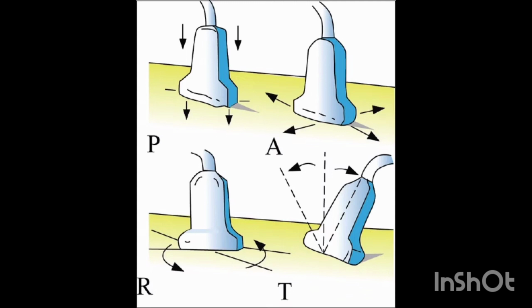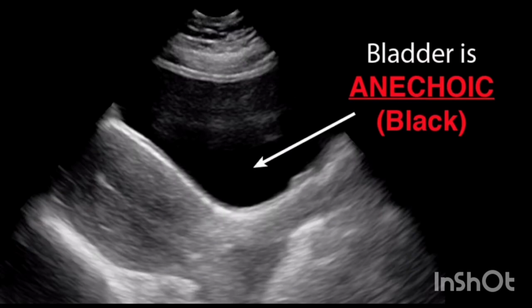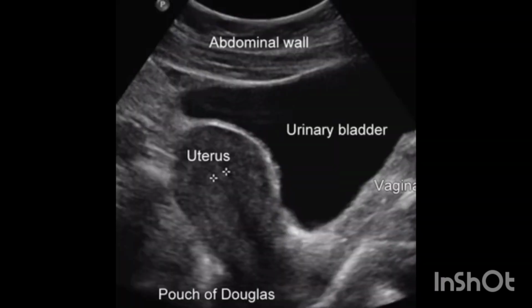The transducer should be selected to operate at the highest clinically appropriate frequency that will allow adequate visualization of deep pelvic structures. For transabdominal evaluation, a 3.5 MHz or higher transducer is employed. Curved linear array, as well as sector transducers with a smaller footprint, are often employed. For transabdominal evaluation, the bladder should be adequately distended to displace bowels superiorly out of the true pelvis and provide an acoustic window to visualize the uterus and adnexa.